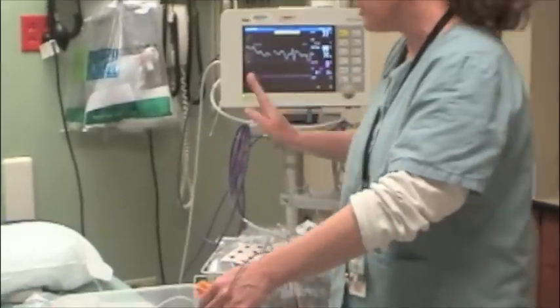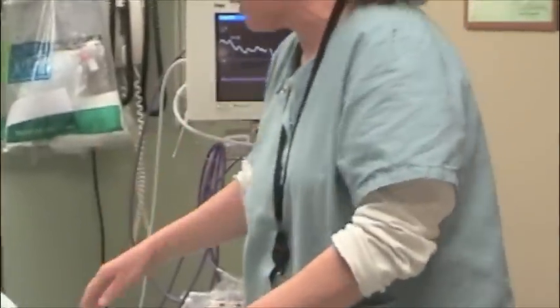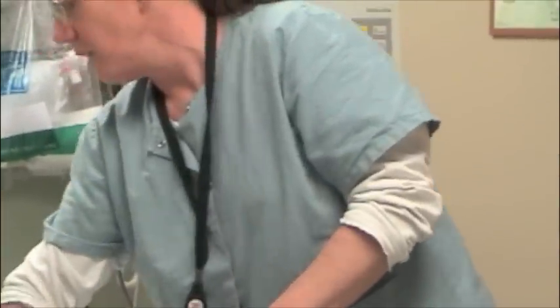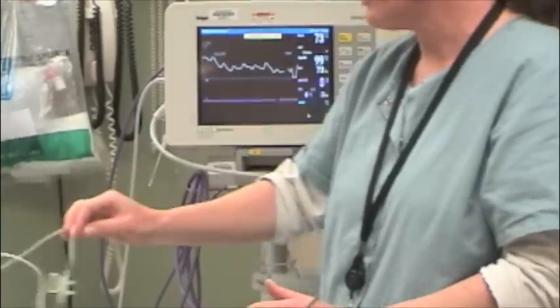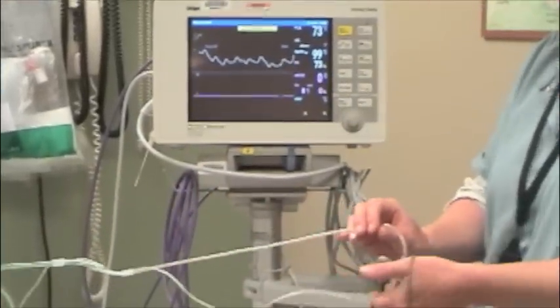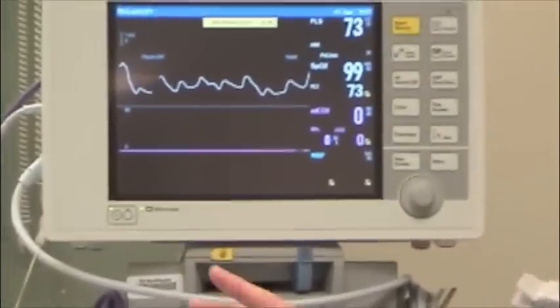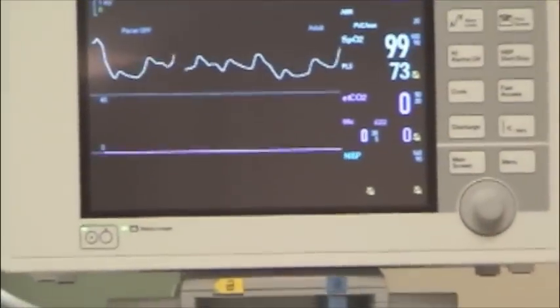There's no need to zero it — it's self-calibrating. I'm going to ask my assistant Amanda to slowly get close to this so we can get a capnography waveform.